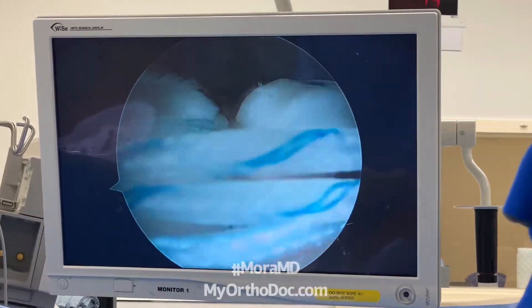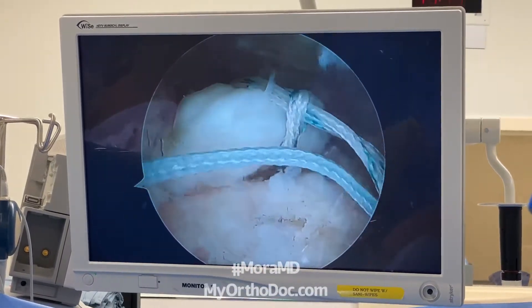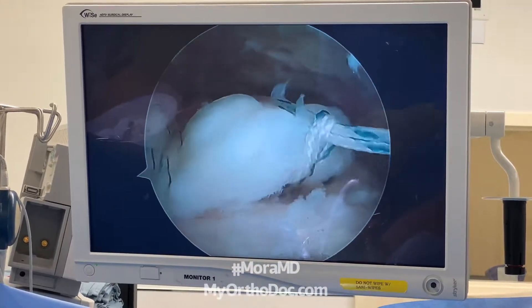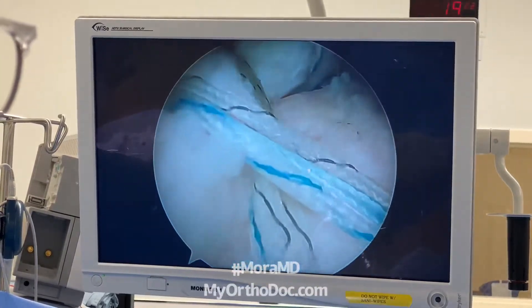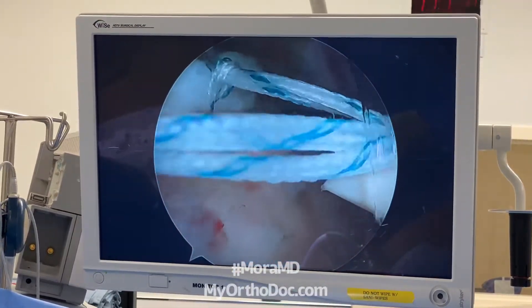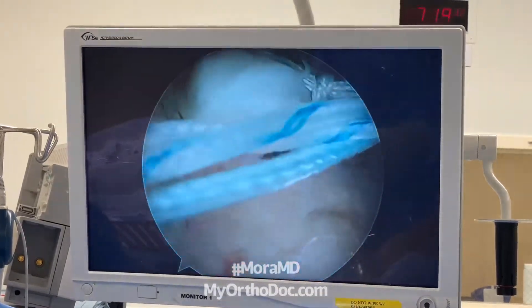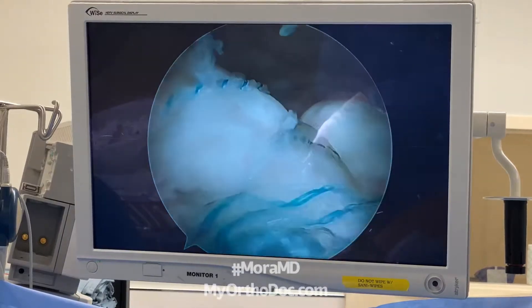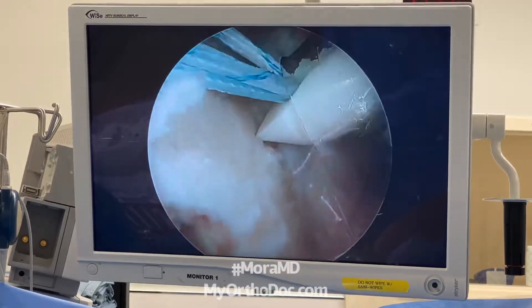Now what I'm doing is what's called a suture bridge technique, where I actually use the sutures themselves to push or bring down the most lateral edge of the rotator cuff. You can see how it does that. I've also created little holes or channels — micro-fracture type channels — that will bring in blood. These sutures are being used to actually compress the lateral edge of the rotator cuff up against bleeding bone.